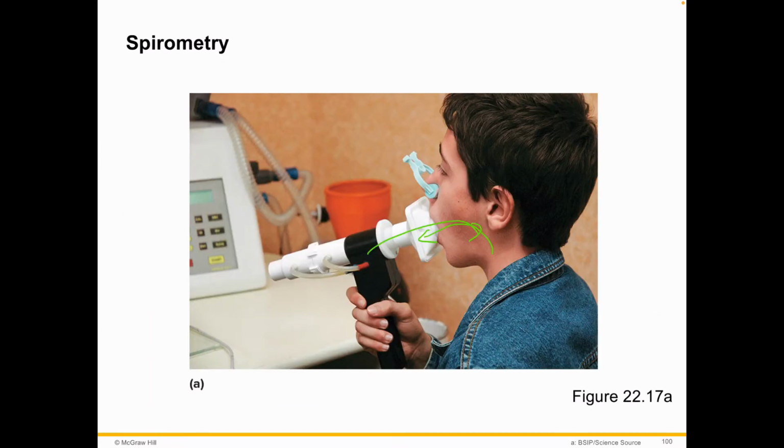Oh, there he is doing it, right? I'm guessing that's the spirometer. But some of them are really tiny. It's literally like a pressure gauge, right? Here's a little pressure gauge and here's all the numbers. And then here's the box and then there's a tiny little tube. You can fit the sucker in your pocket. It's tiny.